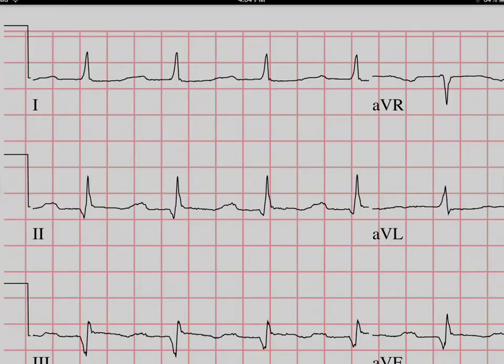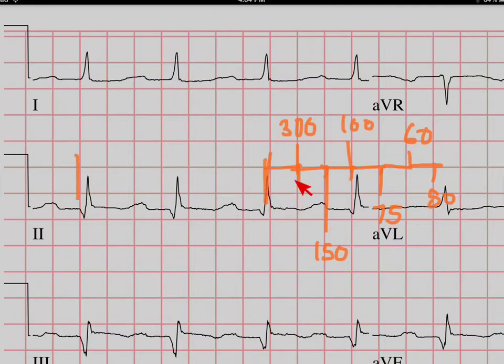There's another way, and that involves counting the number of big boxes between two consecutive beats. You try and find one that's fairly close to being on one of these lines. This one's pretty close - we'll see how many boxes are in there: 1, 2, 3, between 3 and 4. You can calculate the rate by counting each box: 300, 150, 100, 75, 60, 50. So if the next beat fell after one box, that's 300 beats per minute; after two, 150; after three, 100; after four, 75. Here we have something between 100 and 75, much closer to the 100 side, so I'd guess around 90 beats per minute - which is what we calculated the other way.